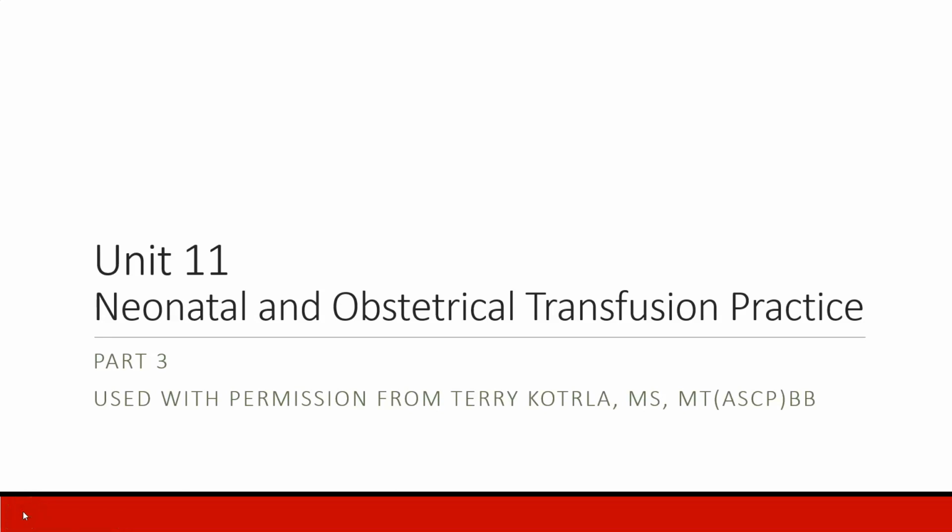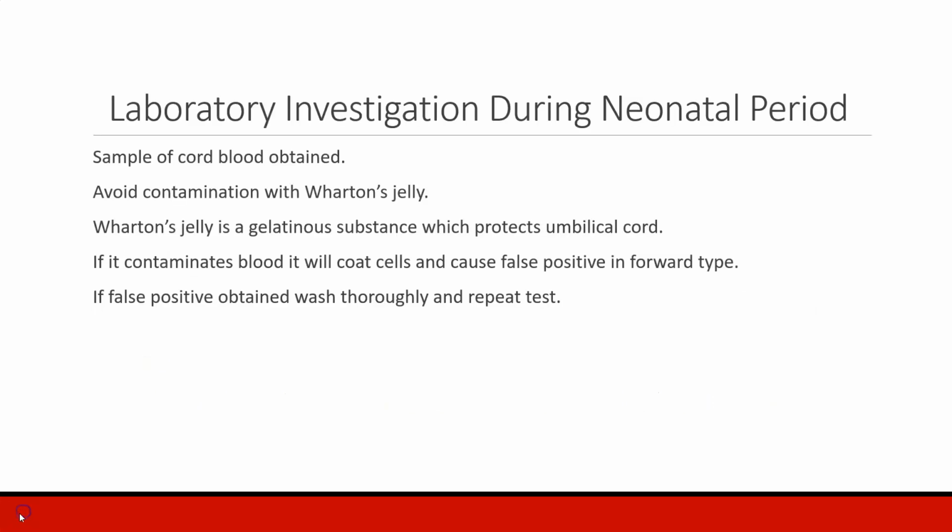This is part 3 of Unit 11, Neonatal and Obstetrical Transfusion Practice. This part will focus on the laboratory investigation during the neonatal period.